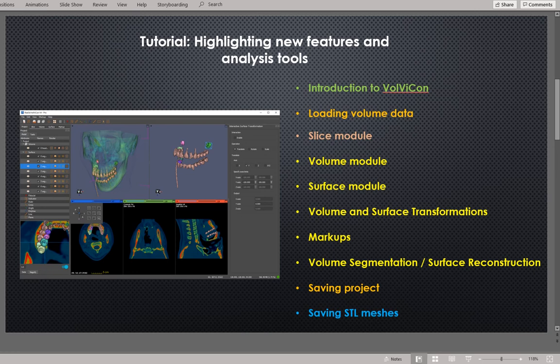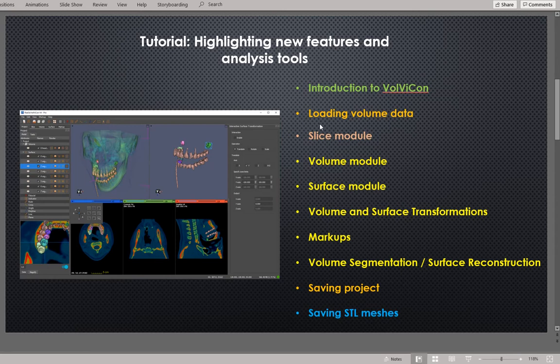Welcome to this tutorial highlighting new features and existing analysis tools available in Volvicon version 4.2. Volvicon is an application for three-dimensional visualization and image analysis — it provides a set of tools to analyze both surface and volumetric data. In this video I will introduce the interface, then cover the slice module, volume module, surface module, and the interactive transformation tool for surface and volume data.